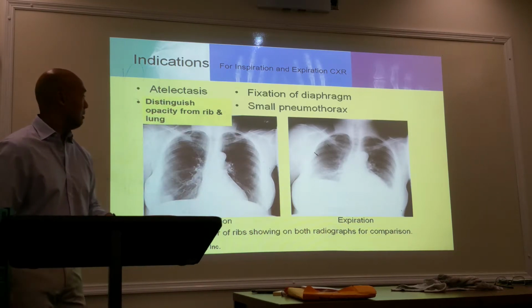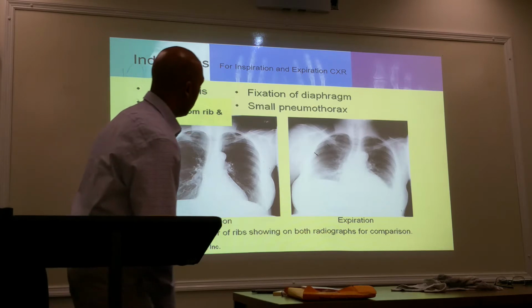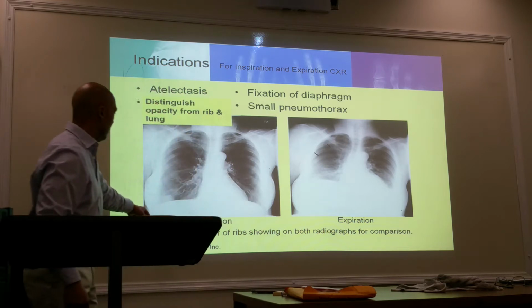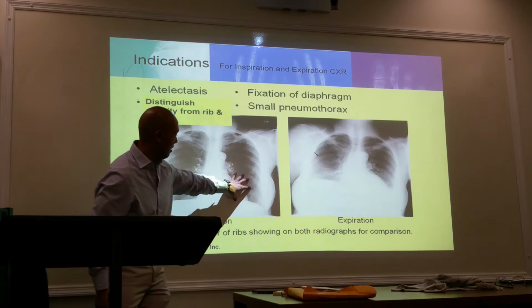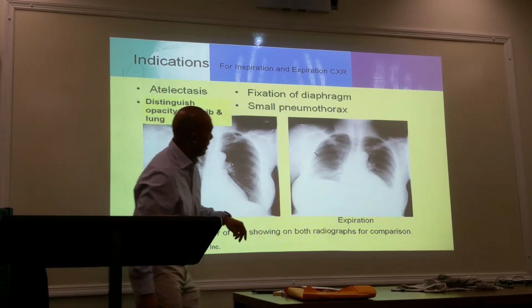Is that a collapsed lung right there? On the right? This one over here? No, the other one. The other image, but the other lung, the left lung. This left one here? Yes. No. Oh, okay. No, this is just over penetration again, but I can see some lung markings in here.